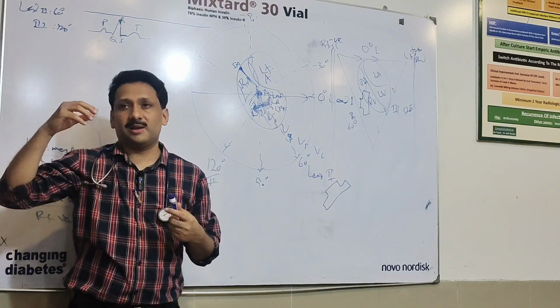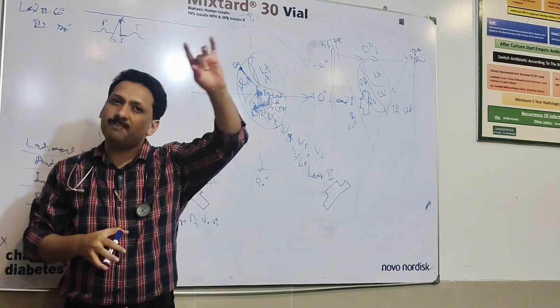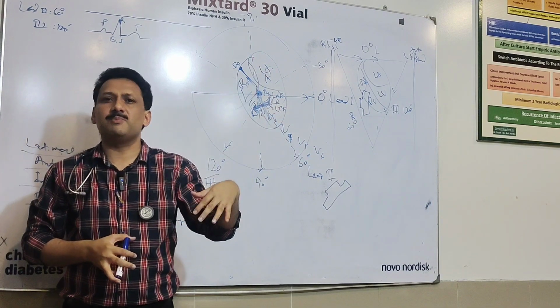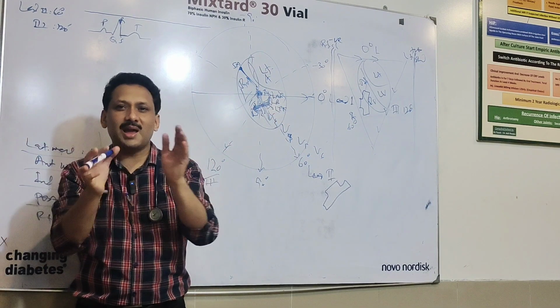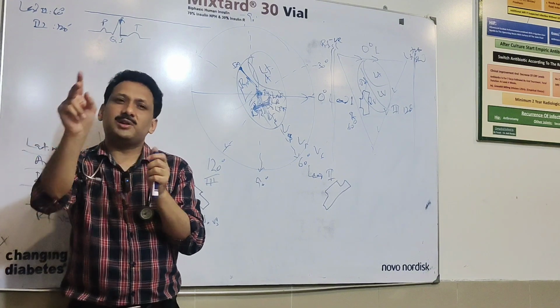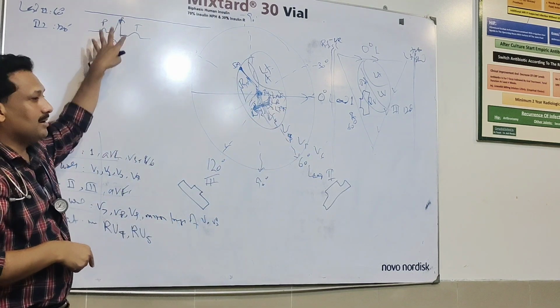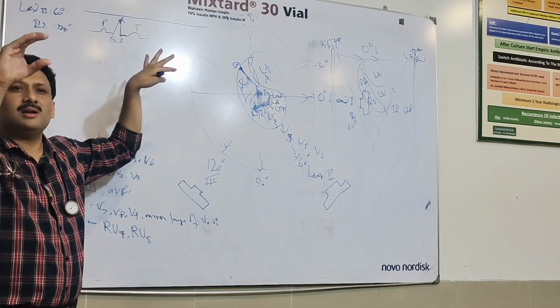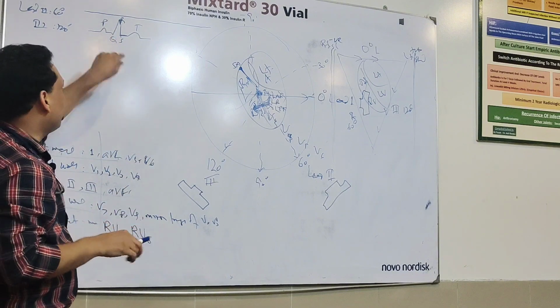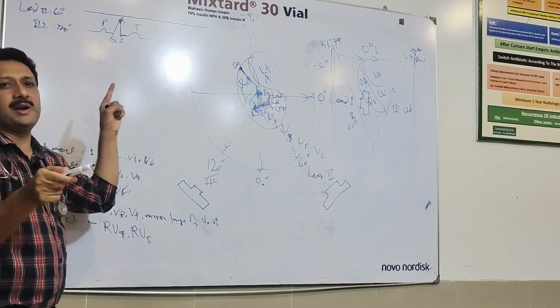One can ask this question: the way the ventricle is repolarizing, the atria and the septum should also repolarize, and yes, they do repolarize. But exactly at the same time as they form that repolarization wave, the ventricle forms the big depolarization wave, and they are hidden or masked inside that depolarization wave. So basically they do repolarize, but it is all masked inside. That's the total picture. But why that picture is different in different leads, this is what I am going to tell you.